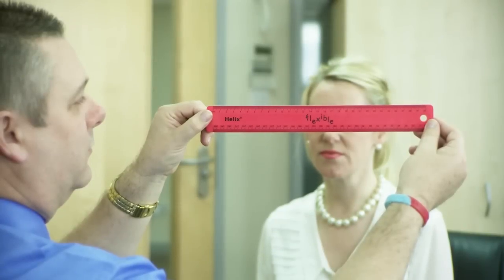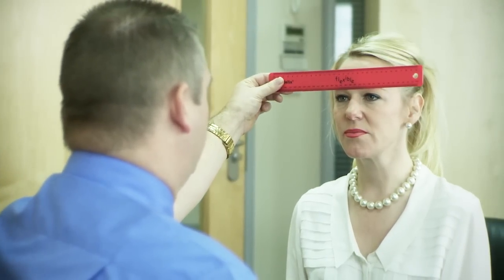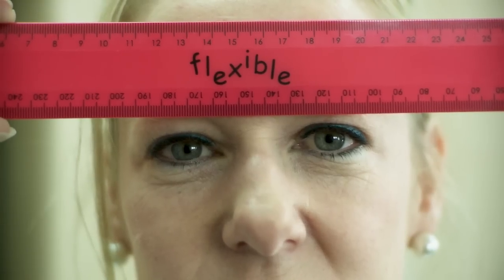If you don't have a PD ruler, you can use a standard ruler with millimeter measurements. Taking the same position with your helper as before, the person taking the measurement should rest the ruler firmly against your forehead to keep it steady.